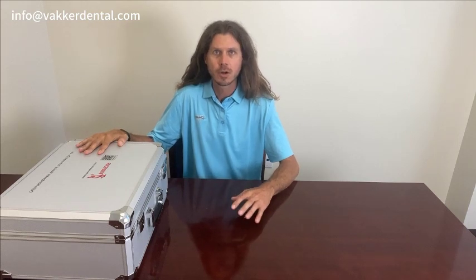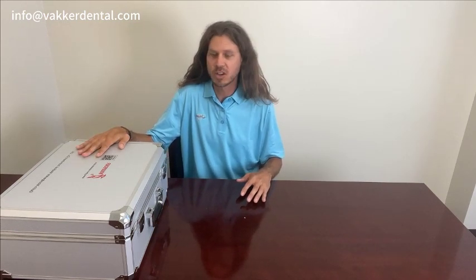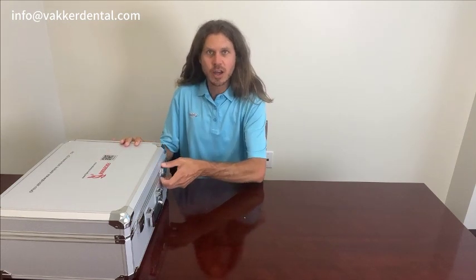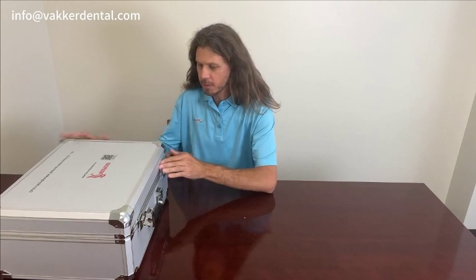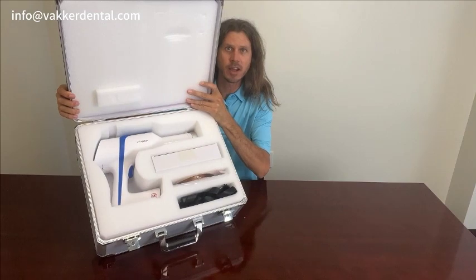First off, the AI Ray Pro does come in this nice travel case here, which is really nice if you're moving from office to office and you want to make sure that you can travel with your x-ray and it'll be nice and secure inside this nice padded box. Let's go ahead and open it up here and take a quick look. Here's how it comes — nice foam, nicely packed in there, nice and tight.